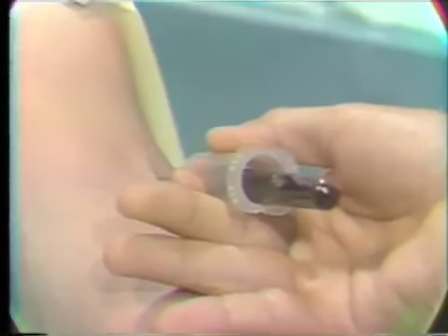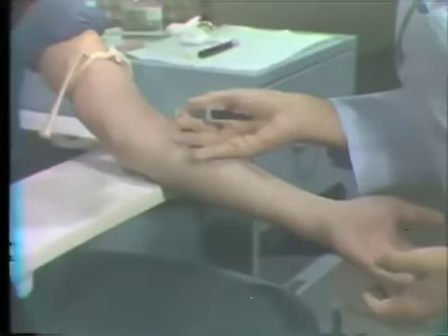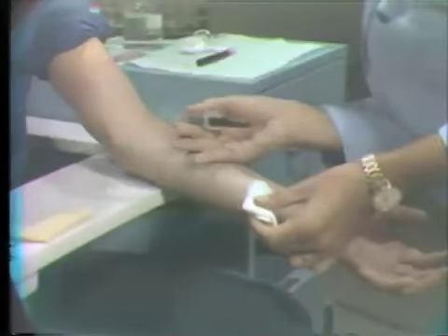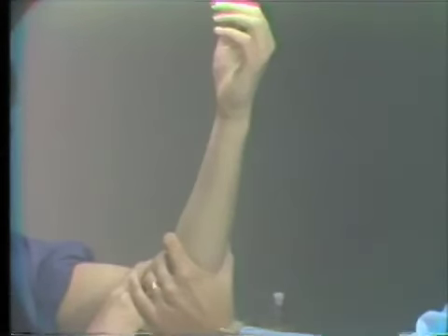Now, after I have attained as many tubes as I want, I tell the patient to release the fist, have the patient relax, release the tourniquet, get my gauze, pull the needle out, and correctly place a lot of pressure holding the patient's arm up. The patient will hold that. Again, we will then bandage the patient's arm up, and that is the only difference in the Vacutainer technique.